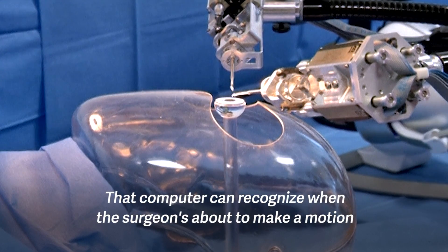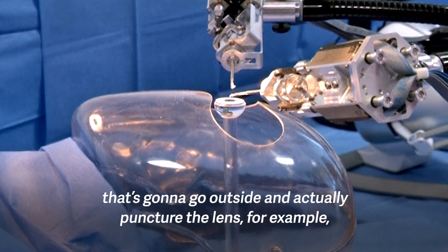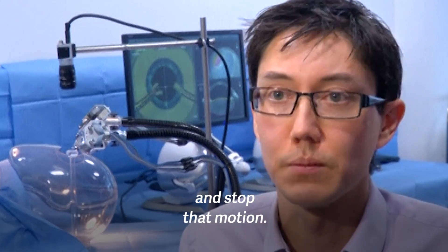That computer can recognize when the surgeon's about to make a motion that's going to go outside and actually puncture the lens, for example, and stop that motion.